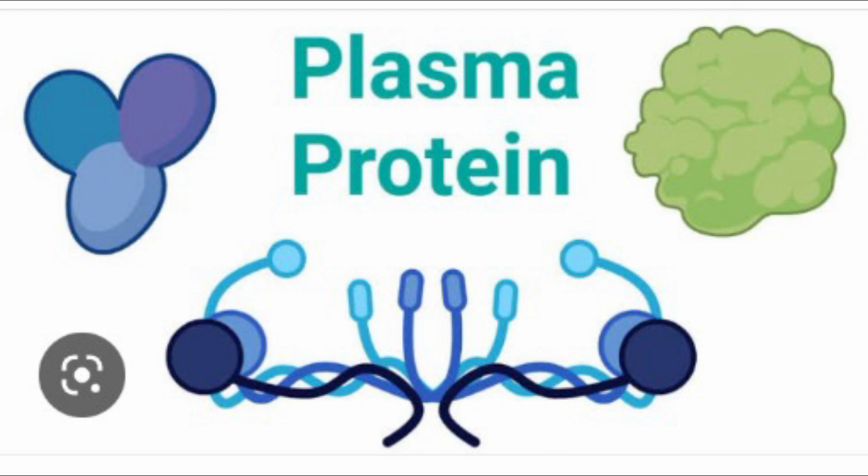Semi-quantitative determination of microalbumin. This test is based on the principle of immunochemical reactions. Hence, this test is very specific for albumin and very sensitive. The test strip contains a specific antibody for albumin, a substrate and an enzyme. When the strip is dipped in the urine, the albumin reacts with the antibody of the strip and forms a complex. This complex reacts with the substrate and forms a red color. This test is useful for early detection of albuminuria, especially in diabetic nephropathy and hypertensive patients.